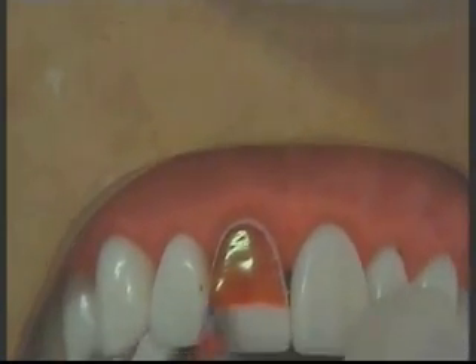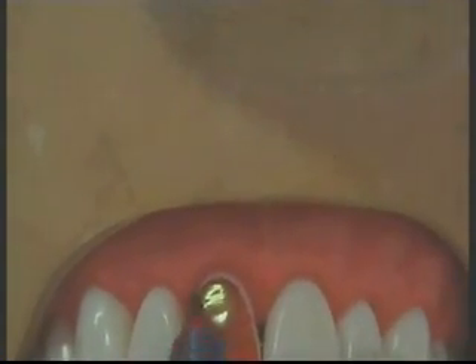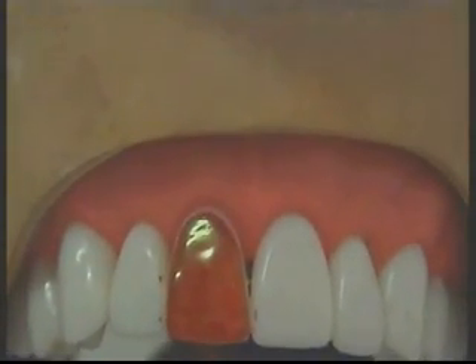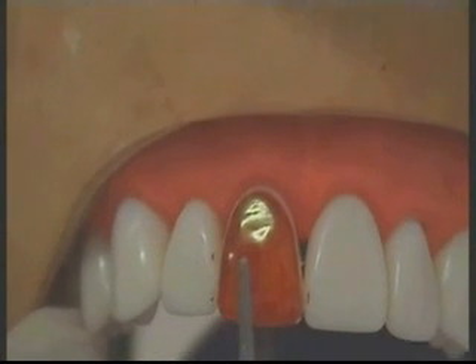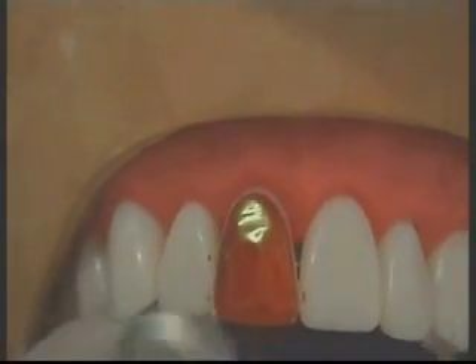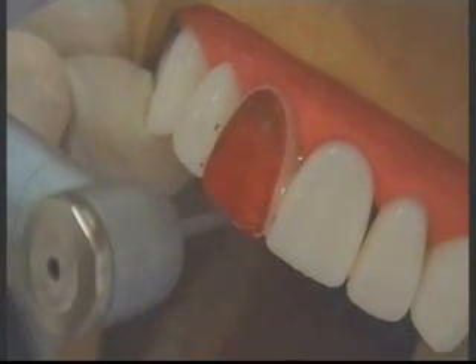I am just marking on the labial surface so that it will be easier to see in the video. We are going to start with the incisal reduction first, followed by the axial reduction in the form of the labial. This is the bur which we are going to use — see the tip, it is flat. The name of the bur is flat-end tapered diamond. This is what we are going to use. I am going to start with the incisal reduction.